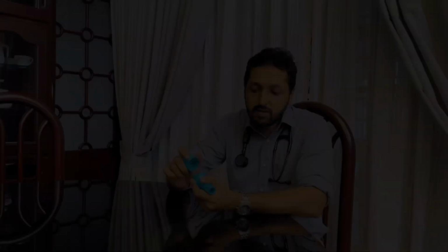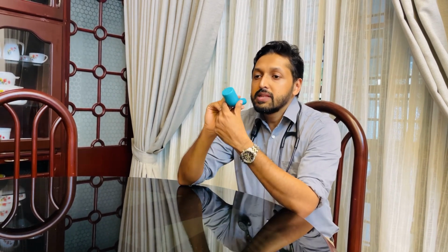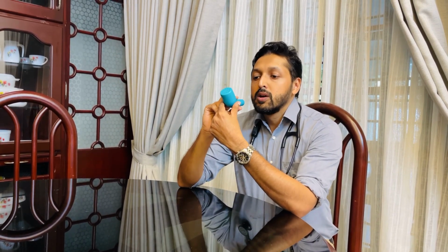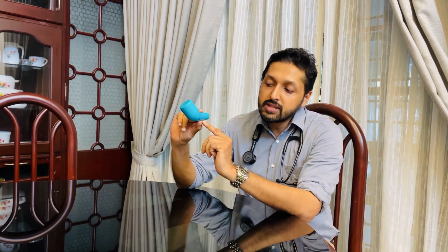How to perform it: you ask the patient to inhale deeply and exhale steadily for up to 3 to 5 seconds. It creates an oscillation due to the pressure of this iron ball. As a result, it helps to loosen the mucus, which occurs due to the vibration. I'll explain to you. Take a deep breath and exhale slowly and steadily. You should know that this limb of the Flutter device should be parallel with the horizontal ground.